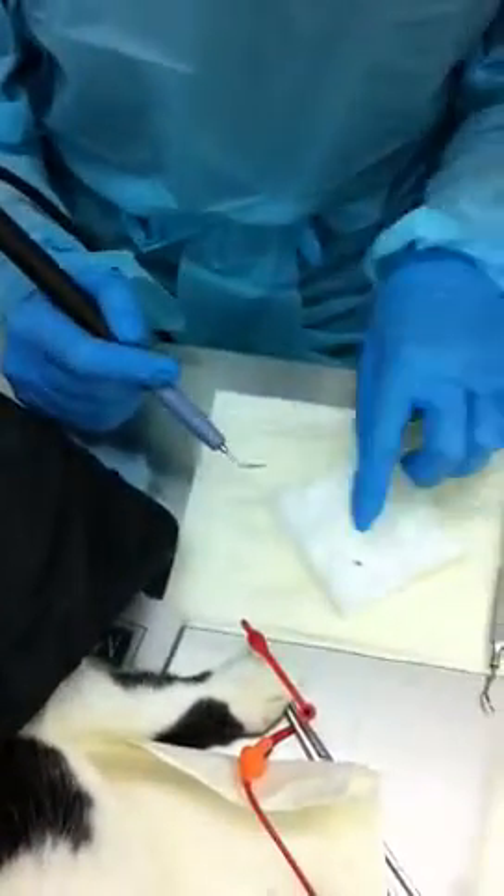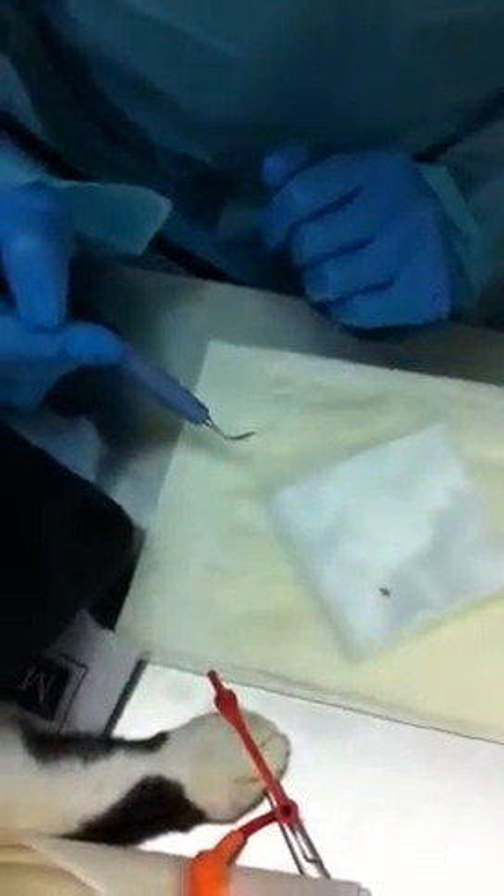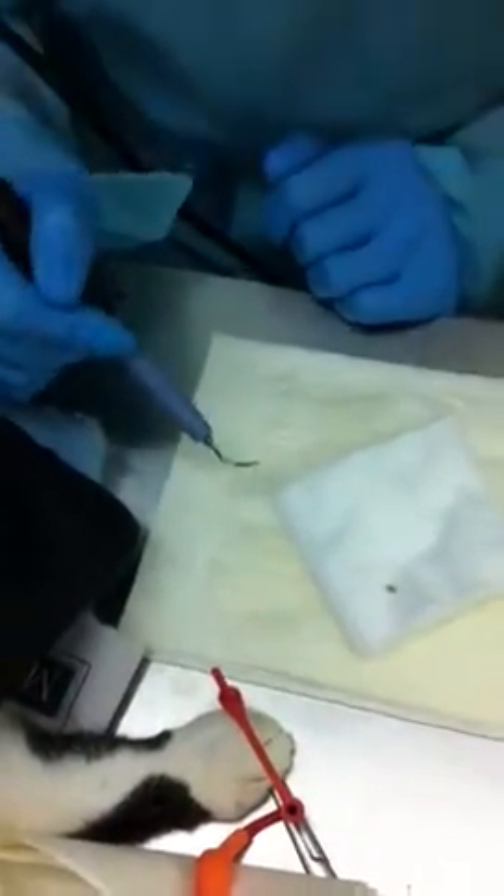Now I'm just going to do some ultrasonic scaling. You can see we've also got some of the plaque off before. I'm just going to test that my water is running because I don't want to start unless I ensure it's going.